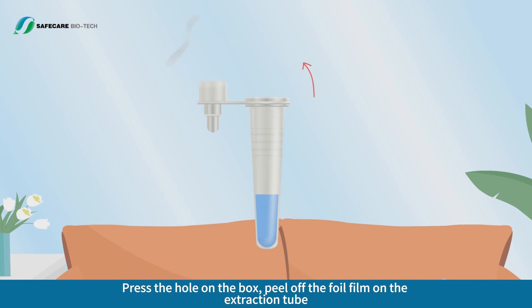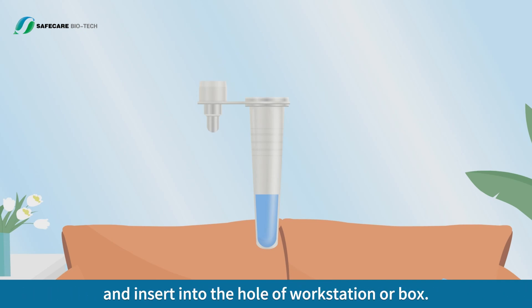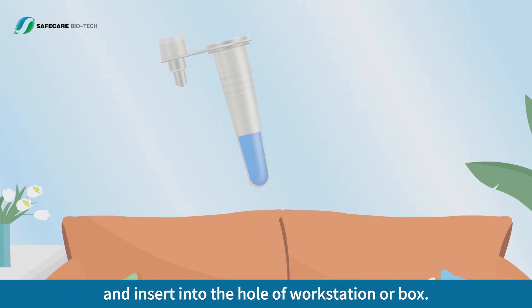Specimen Preparation. Press the hole on the box, peel off the foil film on the extraction tube, and insert it into the hole of the workstation or box.